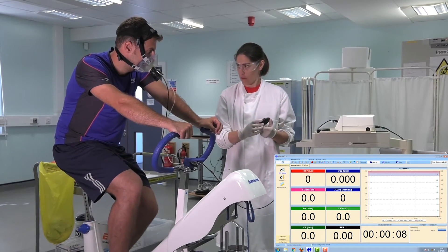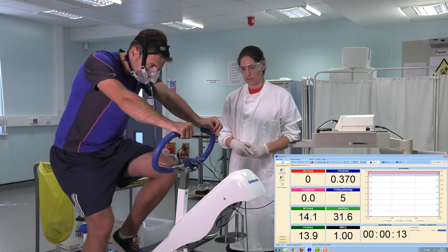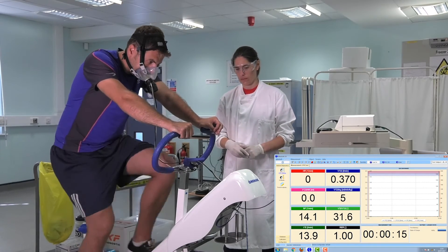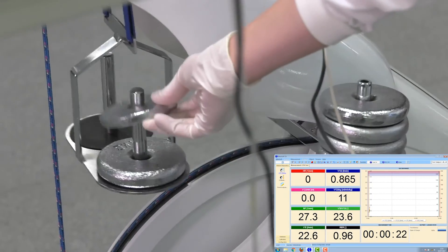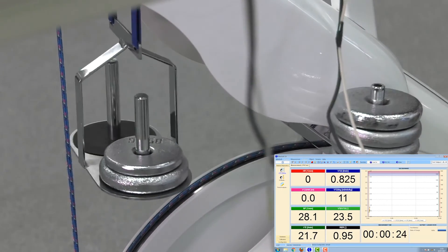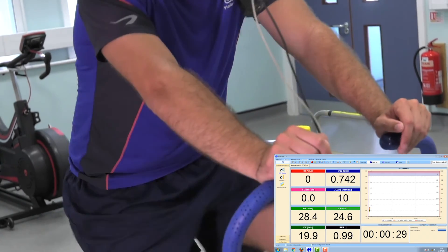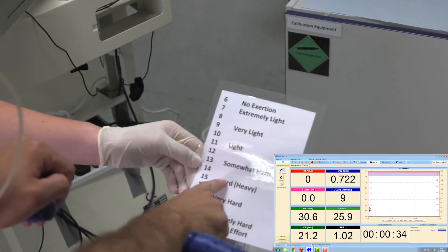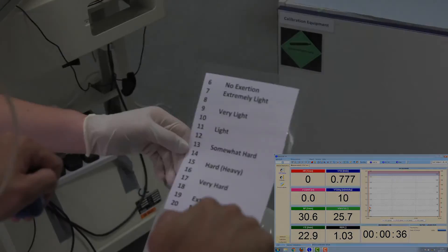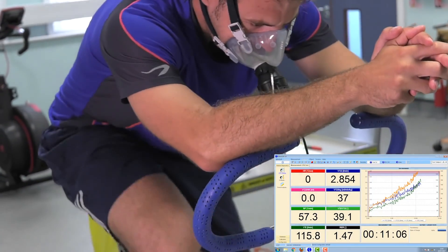Now you're ready to go. Count your participant in — three, two, one, go. They start exercising and you should see the VO2 and VCO2 start appearing on the screen. If you're doing a lactate threshold test, every three or four minutes put a weight onto the Monark to increase the intensity. If you're just doing a VO2max test, it might be every minute — but you need to decide on your protocol prior to the test. Just before the weight is increased, ask them their RPE and make a note of all the results.